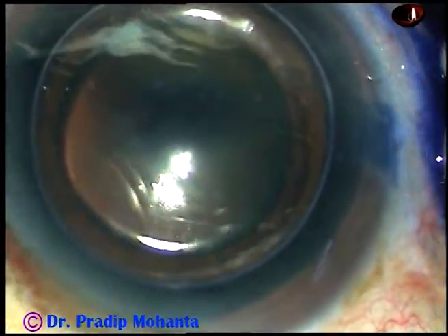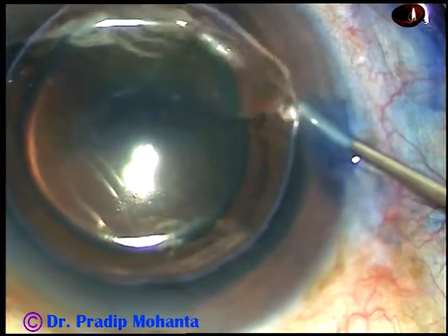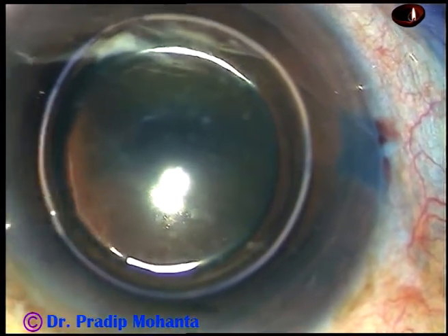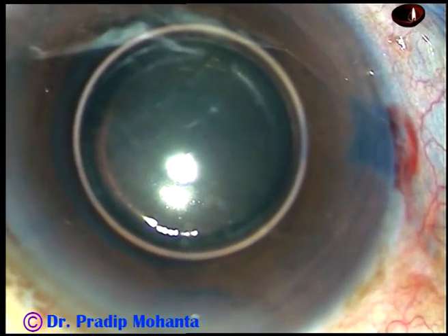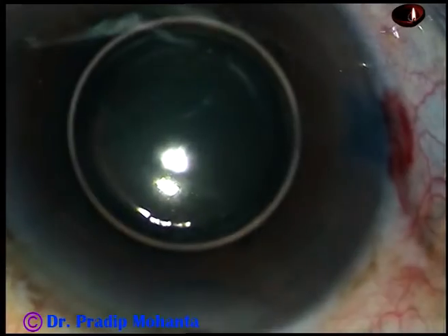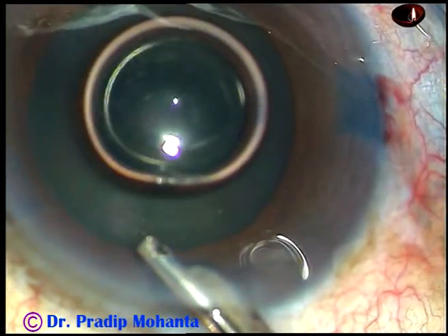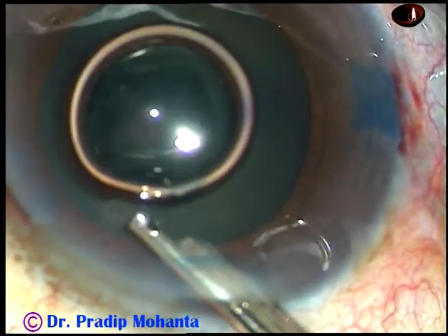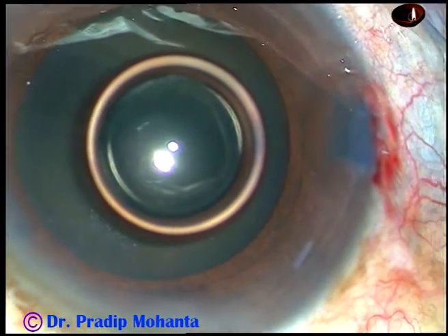Here is the dye. And now a bit of adrenaline diluted 50% is being injected to see if the pupil dilates a little more. The adrenaline didn't have a dramatic effect in this case, but a little bit more dilatation occurred.